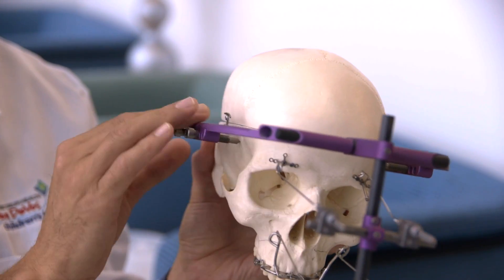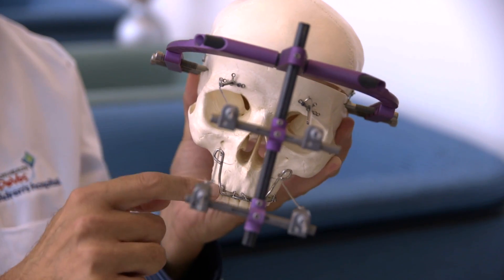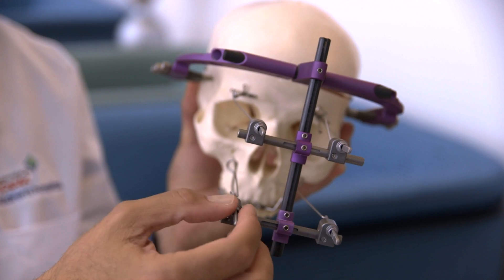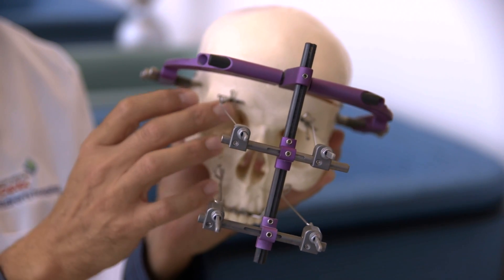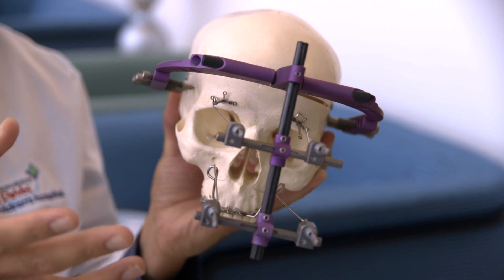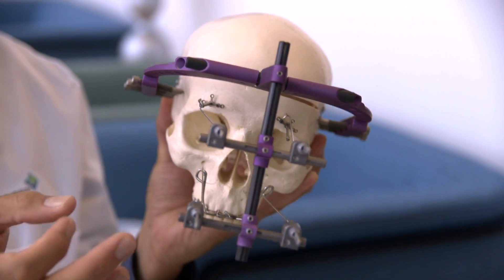To summarize: we have a stable anchorage point on the halo, osteotomized facial bones, and the distraction device hooked up between them. We turn the jack screws, pull on the face and on different portions of the bones, and through that phenomenon of distraction, the patient grows their own bone.